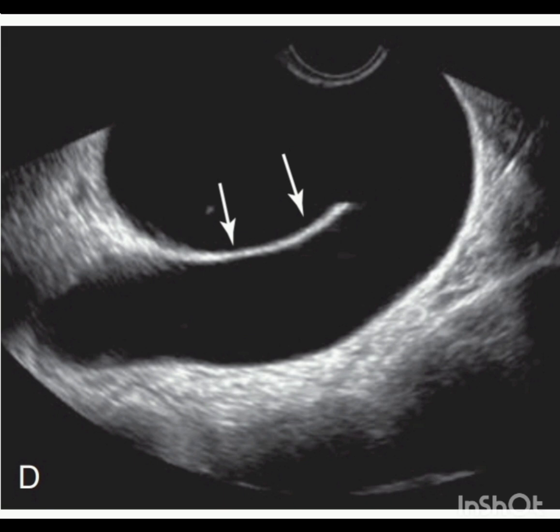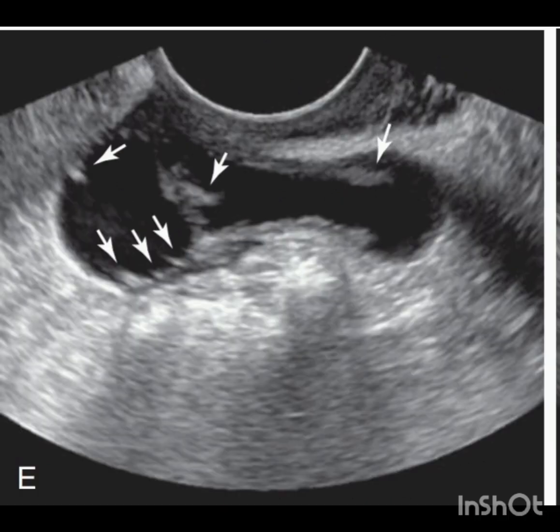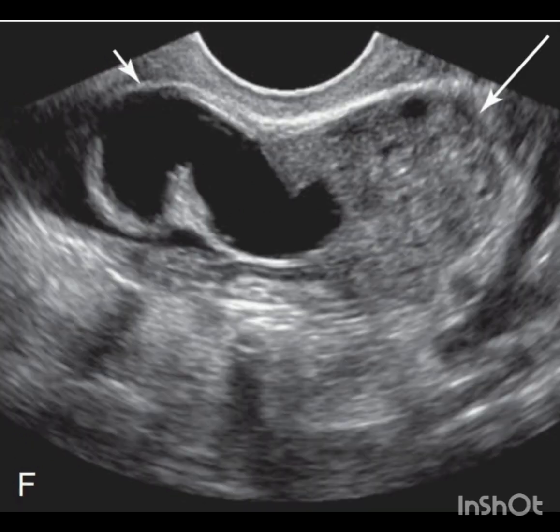Another image of hydrosalpinx with a folded configuration. This image of hydrosalpinx shows nodular areas and linear thick folds along the walls, which corresponds to endosalpingeal folds. In this transvaginal image, you can see a tubular structure, which is the hydrosalpinx, and it is adjacent to the left ovary indicated by the long arrow.